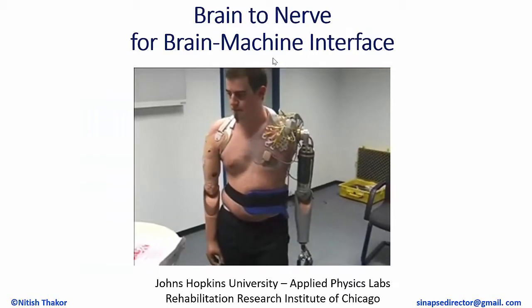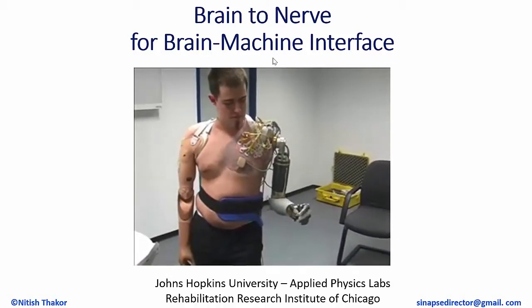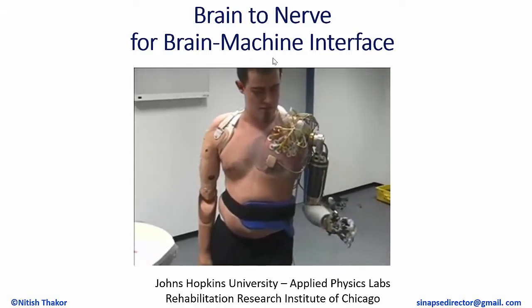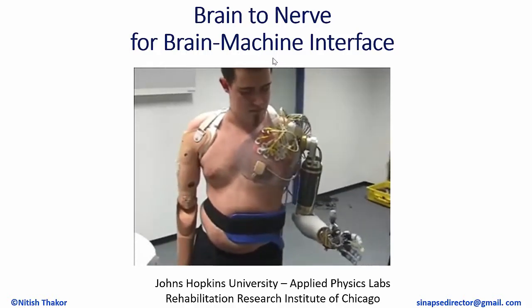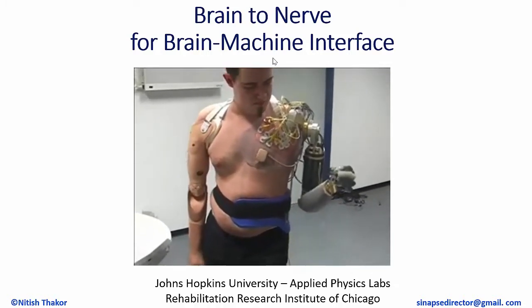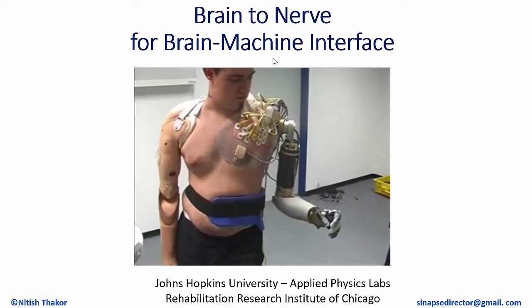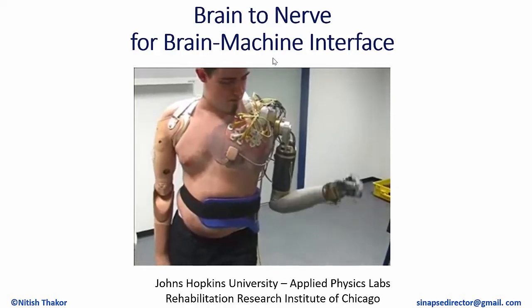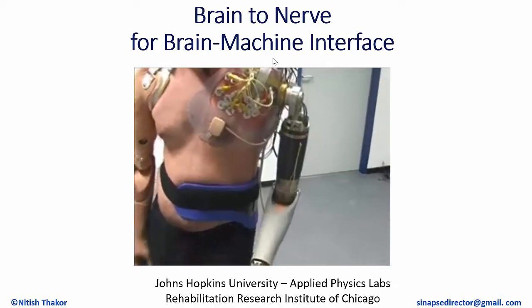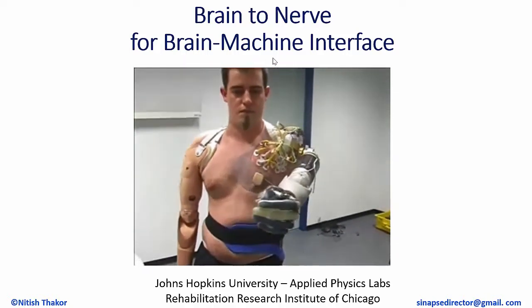There is another way to control a prosthetic arm, and that is picking up signals from the nerves. This gentleman has lost his arm all the way up at the shoulder. So the nerves that carried the signal to the hand or arm are now wired to the chest. You can see some kind of strange movement on his chest, and that movement is decoded to control the arm. This is called targeted muscle reinnervation. You reinnervate the nerves to the muscles and then use the muscle signal as an amplifier to decode a movement of the hand. That's quite a remarkable accomplishment by a number of researchers at Johns Hopkins and Chicago and so on.